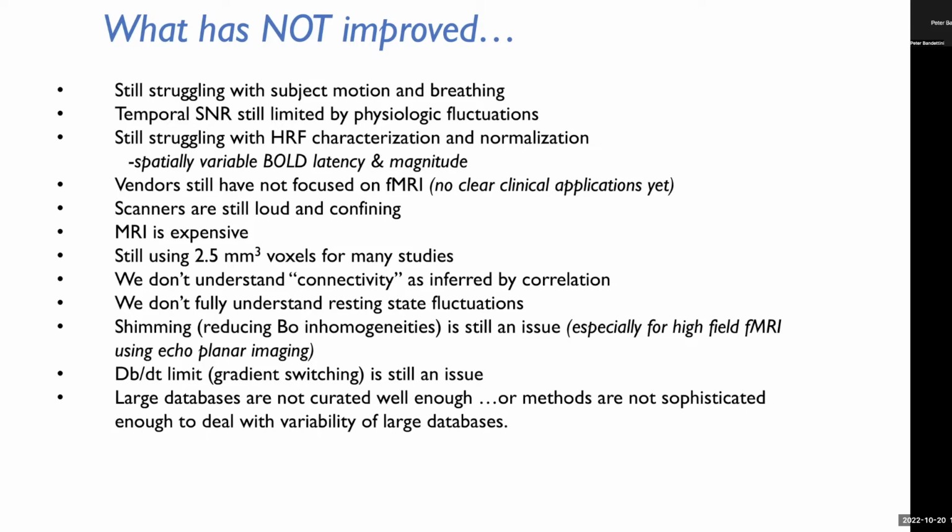Even though we have large databases, they're really not curated well enough. There aren't necessarily any standards for the pulse sequences or the data format. There's a BIDS data format, and there are other types of data formats, but they're still in the early stages of evolution. And it's really hard because it's like hitting a moving target. The methods are developing rapidly. The pulse sequences are still developing rapidly. So it's hard to make these big databases with one standard technique.